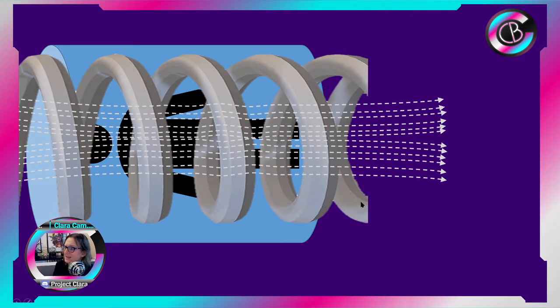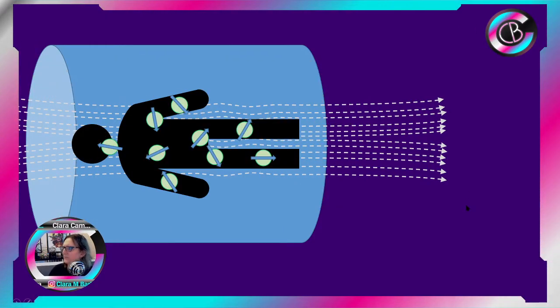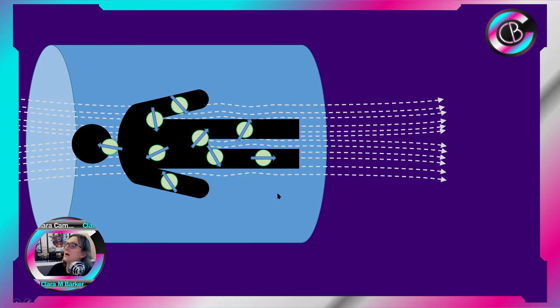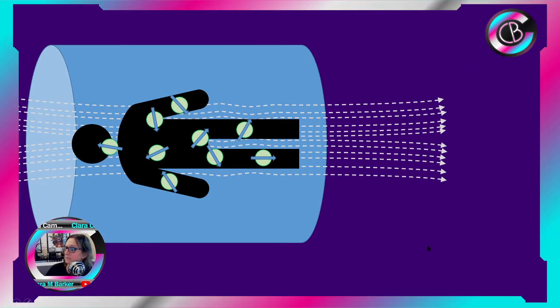Like I say, the big outside electromagnetic superconducting coil is something you're on the inside of, and so we have this magnetic field, which we looked at in the last video. We've got a direction of the magnetic field, and we can control the strength of that. And it's very uniform as well. This is really important. And so what happens is that in the body we've got this magnetic field, and then we've got our human with all the hydrogens, and these hydrogens are all spinning in different directions. They've got this magnetic moment pointing in different directions.